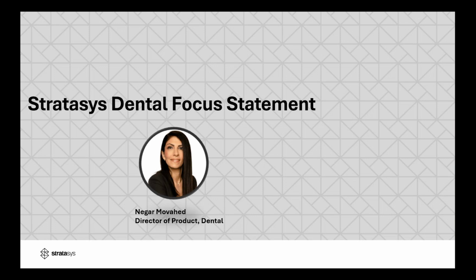I hope you learned a lot from our team and from Ken, especially. I think it's really nice to learn from colleagues in the industry and their experience. I'm sure you can see the energy that we have and how excited and proud we are of this launch. This marks an important milestone for us in our goal of becoming the best digital denture solution in the market.